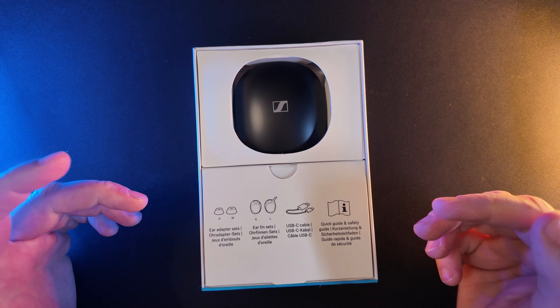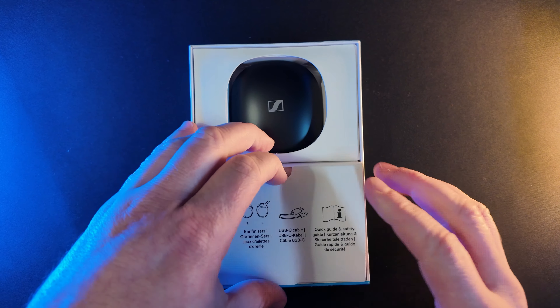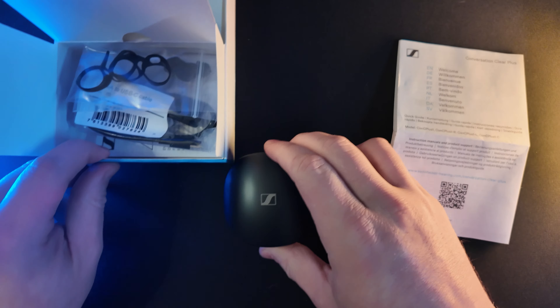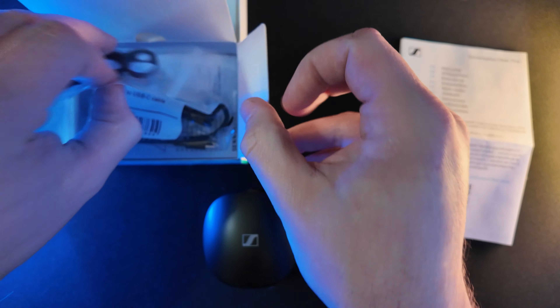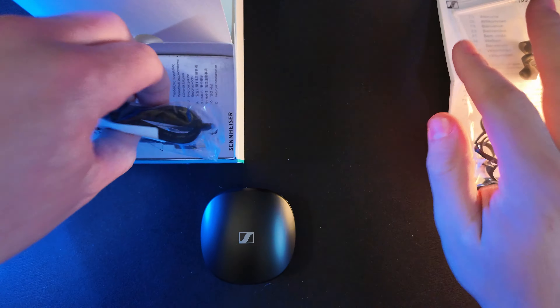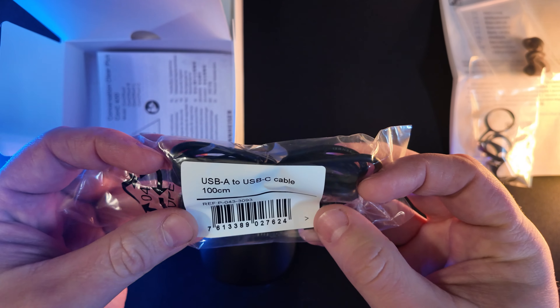You can see some of the benefits here. There's a little card here. We've got ear adapter sets with small and medium — I'm guessing there are probably some already attached on the earbuds. There are also ear fins, which are usually optional and just help keep the bud in your ear. There's a USB-C cable, and a quick start guide with pictures, which is kind of nice. And here are the actual earbuds.